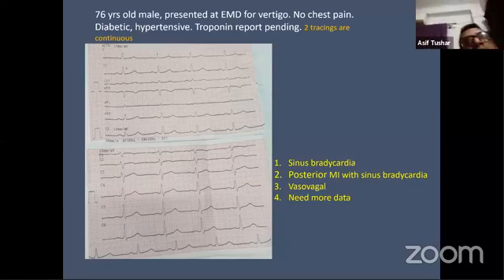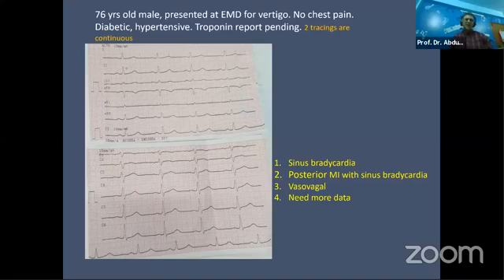If you get a complex which shows very relaxed waves, every P, Q, R, S, T, everything seems a little bit spread out, always look at the speed. Is it proper? All the waves look very relaxed. Is it correct? Because if it is bradycardia, the stroke volume increases because the diastole time is more. And one interesting part of bradycardia is that the T wave can get a little bit peaked, a little bit prominent, but it's not there. All the waves are a little bit spread out, very relaxed. Look at the speed: 50 millimeter per second. So the speed is not proper.